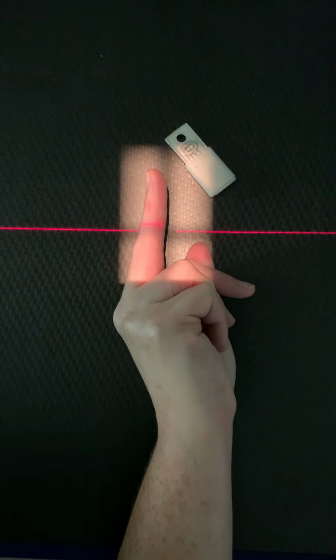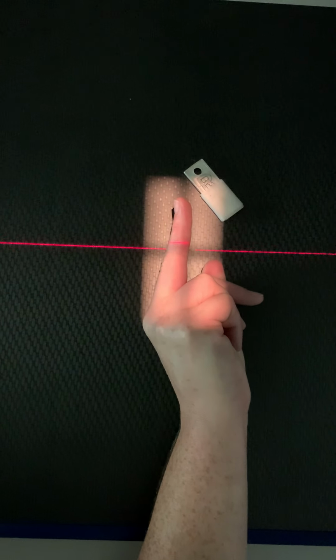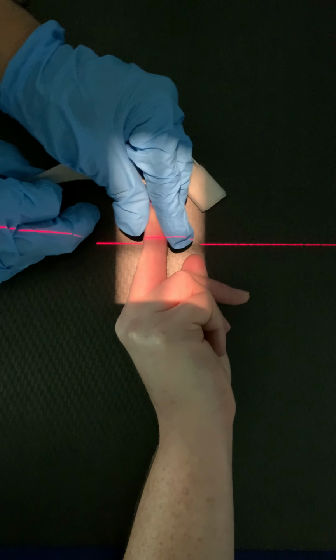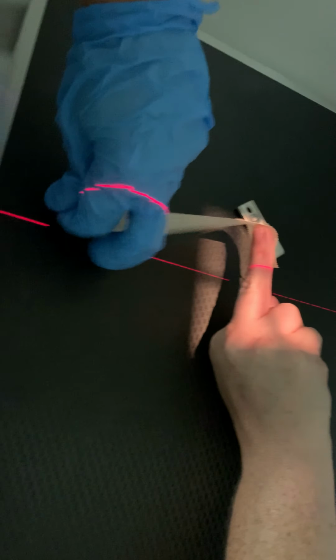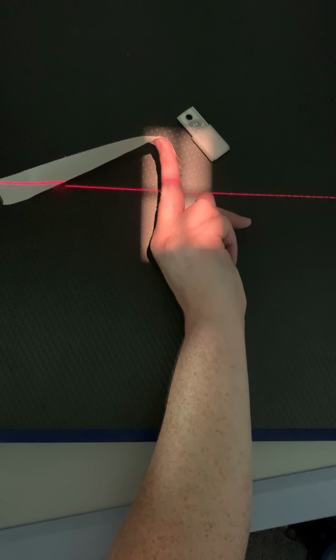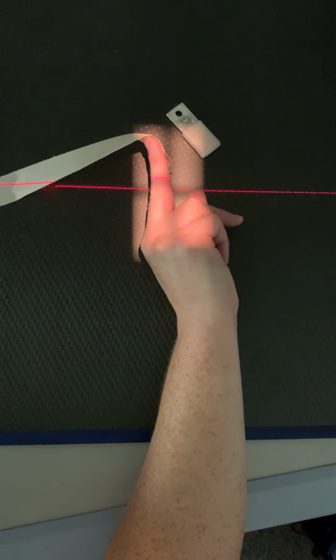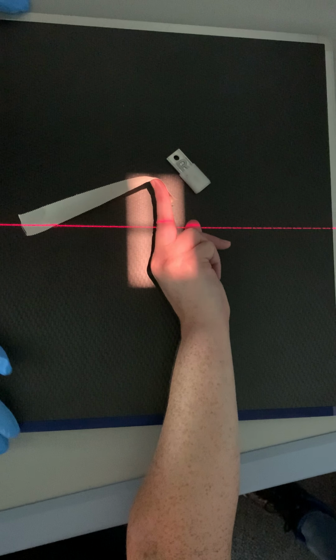So what we'll do is grab some tape and we'll tape that finger back. Just put it right on the tip of the finger here, okay? And then I'll just take it and pull it. And I'll just tape it to the IR. And then I can move my IR to get her centered up. And I can move my tube. Still off a little bit on it. There we go.